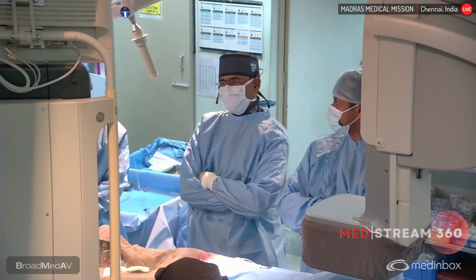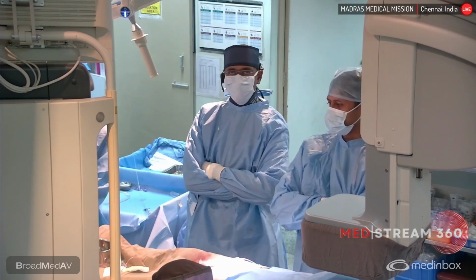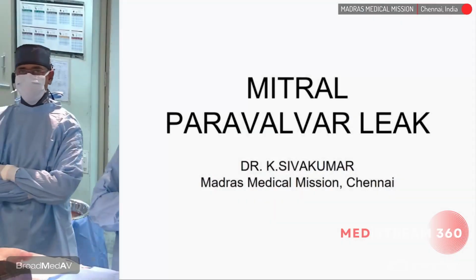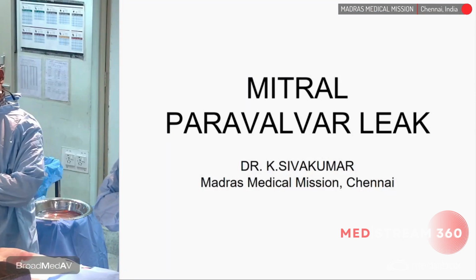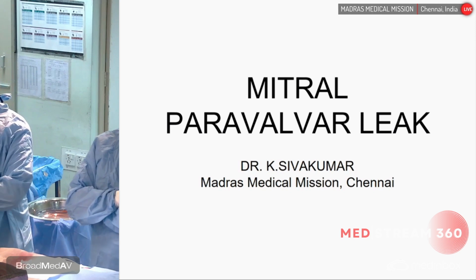I'm Dr. Shivakumar from the Structural Heart Division of Madras Medical Mission, Chennai. And I would like Dr. Anselin, one of my colleagues, to give the clinical details of this interesting patient who has a mitral paravalvular leak, which we are going to address by a transcatheter procedure today.